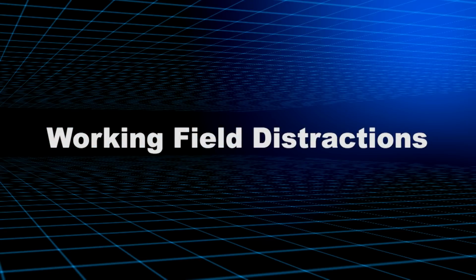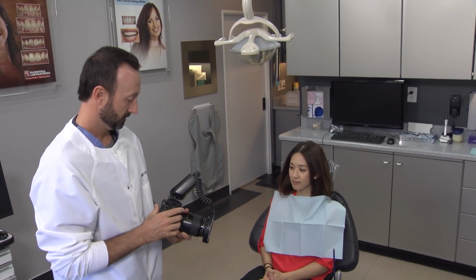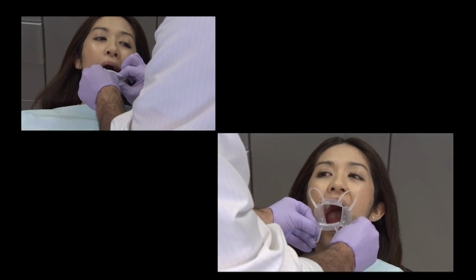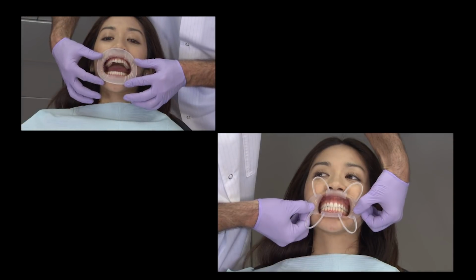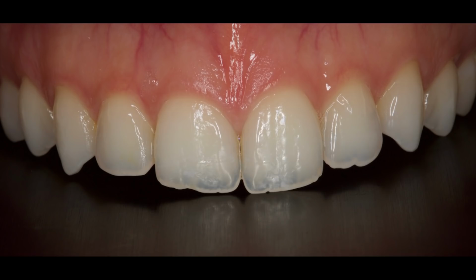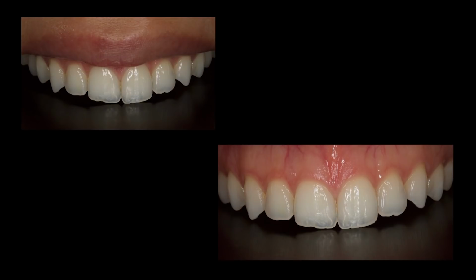In all aspects of dentistry, we learn how to manage an inherently busy working field. Saliva, blood, condensation, and other contaminants, although native to the area, cause serious distractions for high-quality photo rendering. To remove extraoral distractions such as the lips, cheeks, and free gingiva, a multitude of different retraction devices are available to assist the photographer. Blockout devices, such as an intraoral contraster, may cut away even more distractions such as the tongue, throat, and shade variances while highlighting the subject area of the mouth and focusing the eyes towards them. These contrasters can be used with or without lip and cheek retraction as needed.